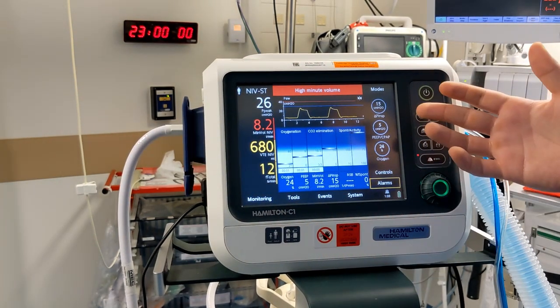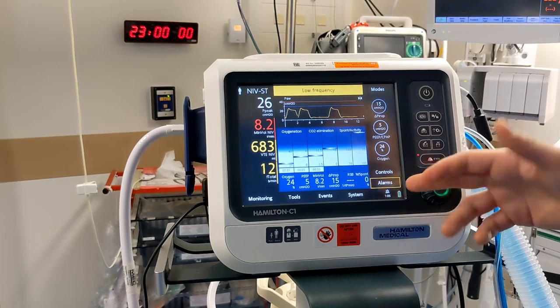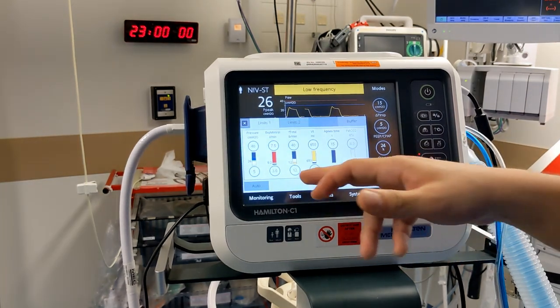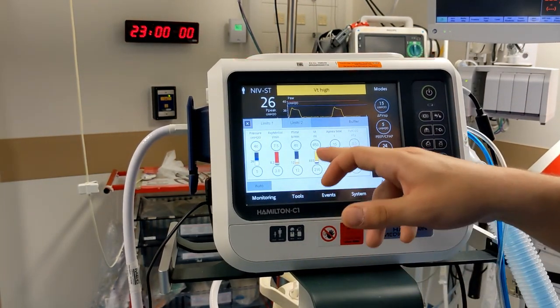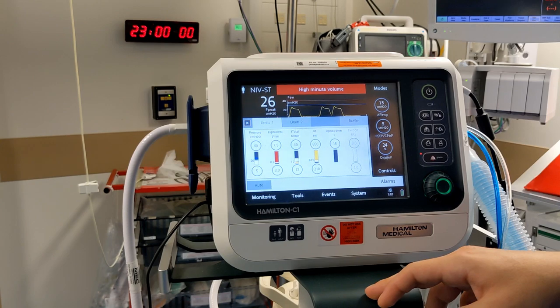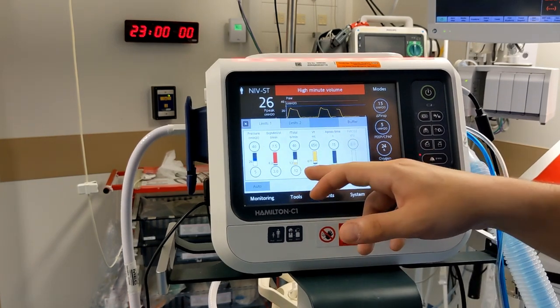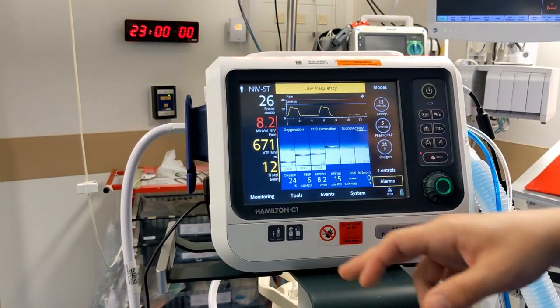If you turn the machine off, it will go back to the default minimum of zero. So every time you turn it on, you need to manually check the alarms and make sure the minimum breaths per minute has been adjusted accordingly.